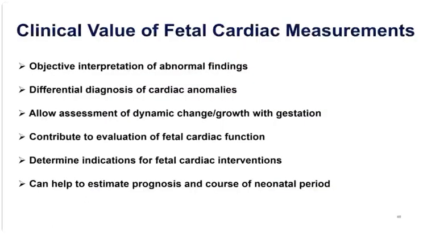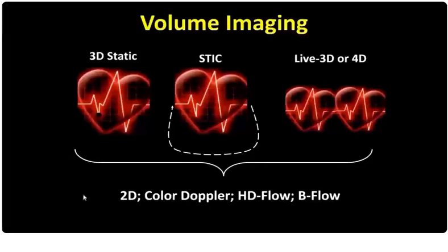So the clinical value of the fetal cardiac measurements: this is the objective interpretation of the abnormal findings, differential diagnosis of the cardiac anomalies, and it allows us to assess the dynamic changes and growth through gestation. It contributes to evaluation in the rare occasions that we consider fetal cardiac interventions, and the measurements can also help in the estimation of the prognosis and the course after birth.